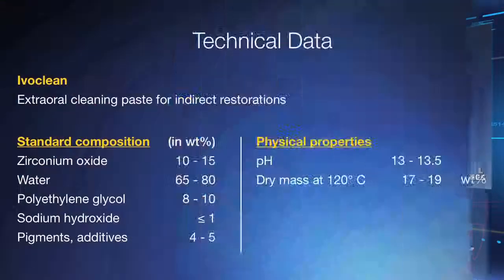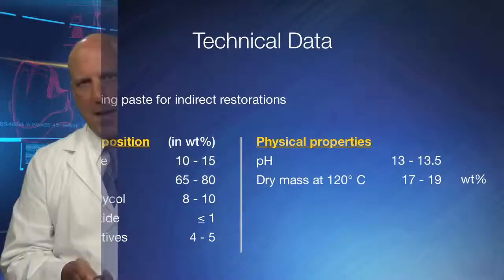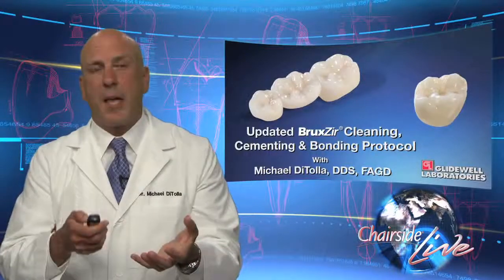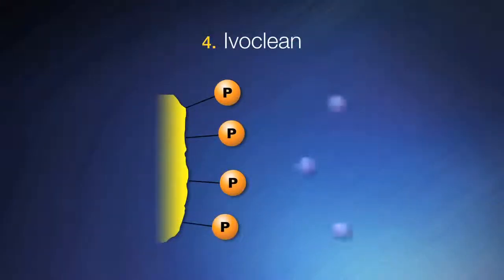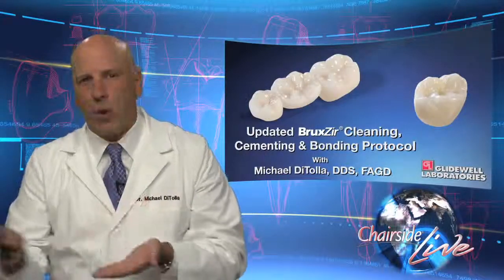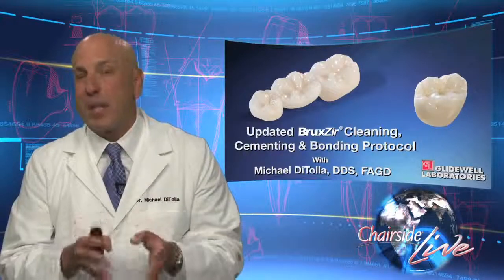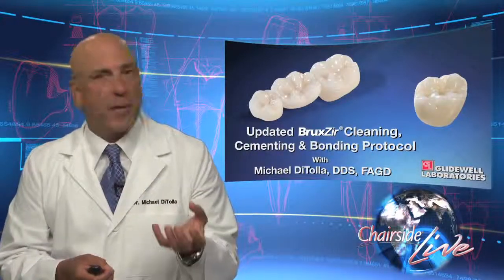It's actually zirconium oxide, about 10 to 15% by weight, in an aqueous solution. We're going to flood the inside of the contaminated BruxZir crown with zirconium oxide. Because of the concentration gradient, we've got so much zirconium oxide free in the Ivoclean that it acts like a sponge, and it attracts and absorbs the phosphate groups from the inside of the BruxZir crown. Those phosphate groups become bound to the zirconium oxide particles in the Ivoclean. Then after 20 seconds, it's simply a matter of washing the Ivoclean out of the crown, and now we have some fresh zirconia oxide bonding sites on the inside of the BruxZir crown that we can take advantage of.